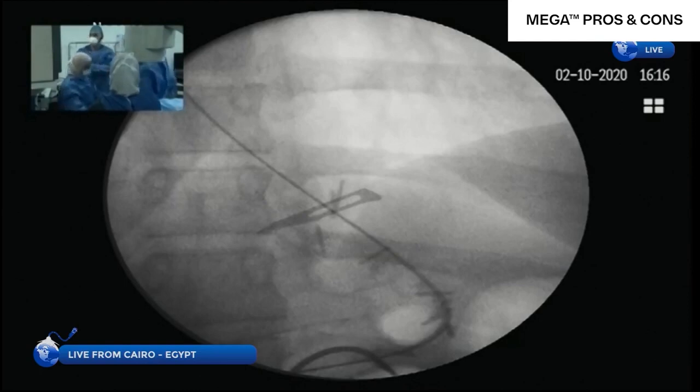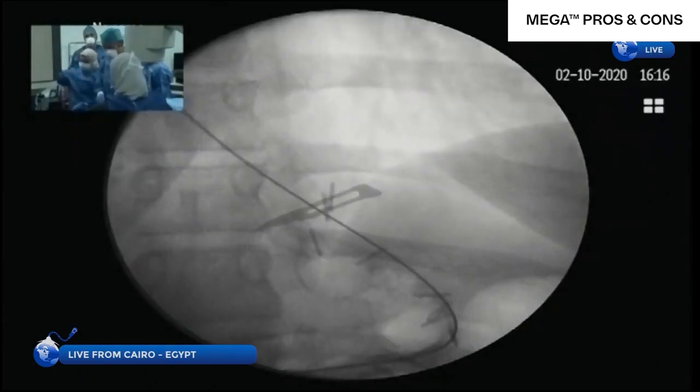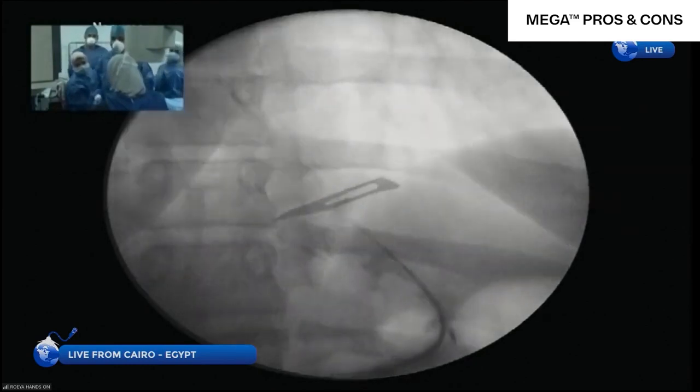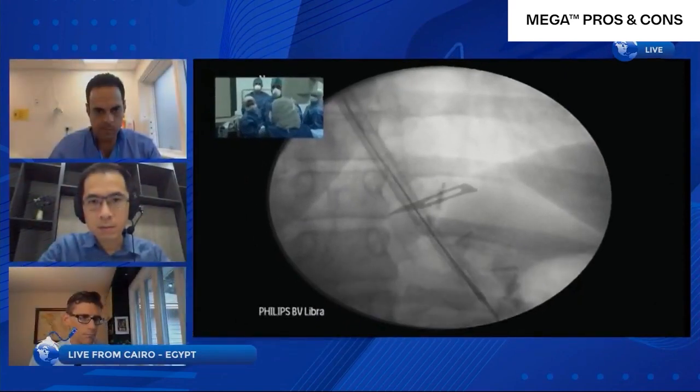Another great advantage of these ultra-large stents is their width. These are giant stents, about 28 millimeters in diameter. So they really reduce the chance of fluid refluxing around the stent and coming up again, which is something we see with smaller, partially covered stents like the Ultraflex. But again, different schools. I sometimes use the partially covered stents, and sometimes I go ahead with the fully covered. It depends on the situation in the patient, how large the esophagus is.